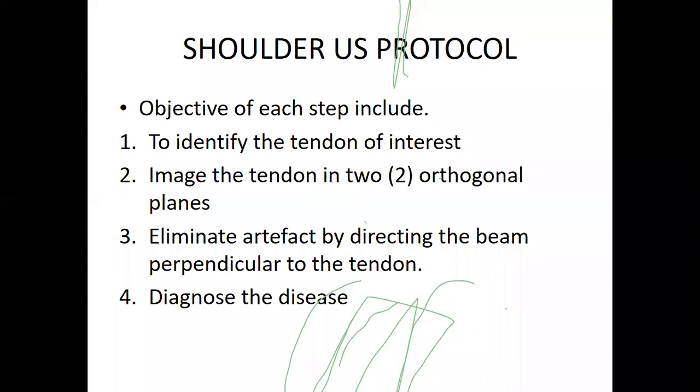And in each component, there are specific things that we look for. There are anatomical structures that we want to assess, and their related pathologies. The anterior approach has its own maneuvers. While you are performing that particular assessment on the anterior component, there are specific maneuvers a patient must implement.